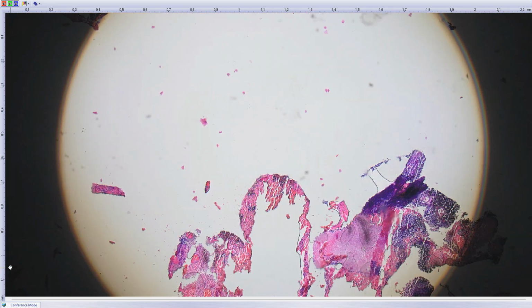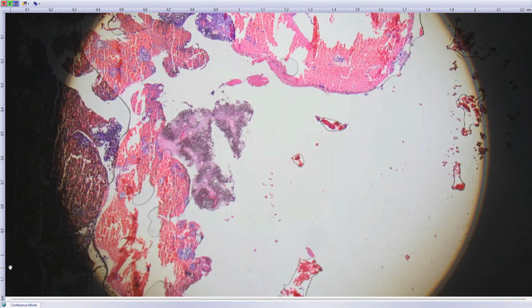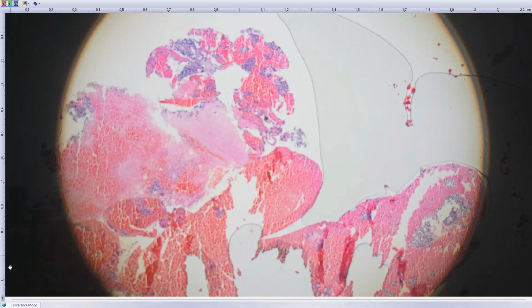And yeah, my last case is one where I don't know the diagnosis. Again, it's a consult. It comes from the brain, and the slides are not very good. We'll try to find it. It's brain? It's a brain lesion, yeah. Maybe here.